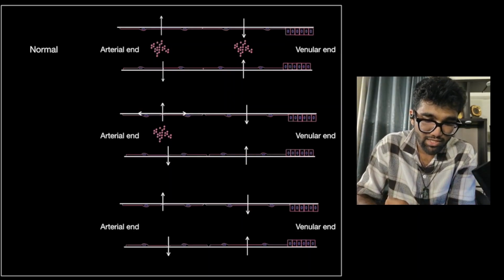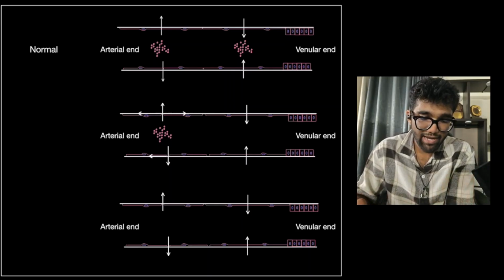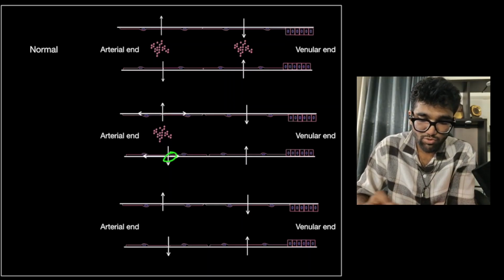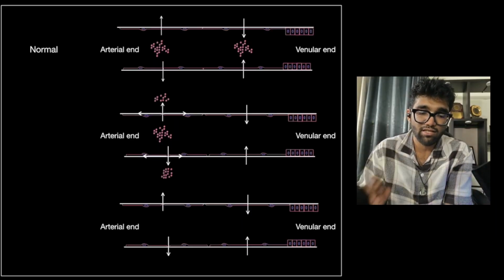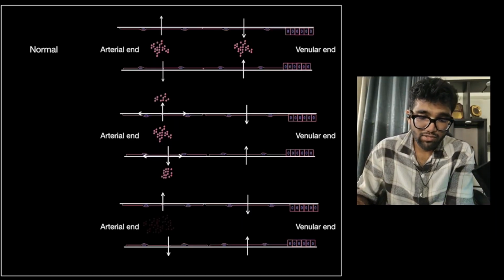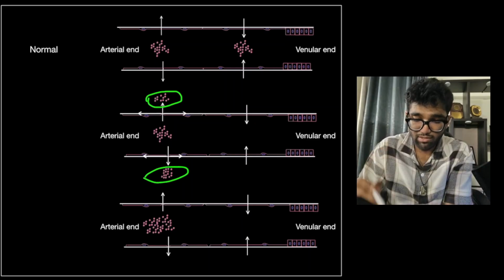Now, what can happen is when you have some kind of endothelial cell contraction, the spaces in between the endothelial cells can become larger. Because of that enlargement of these spaces, you end up having a loss of the protein into the extracellular space. Now, this kind of loss of protein into the extracellular space under the microscope would look like an amorphous eosinophilic deposit around the blood vessel.